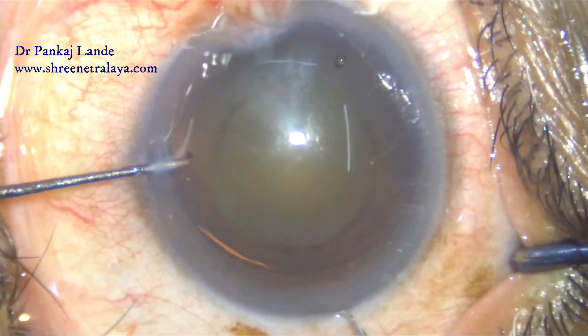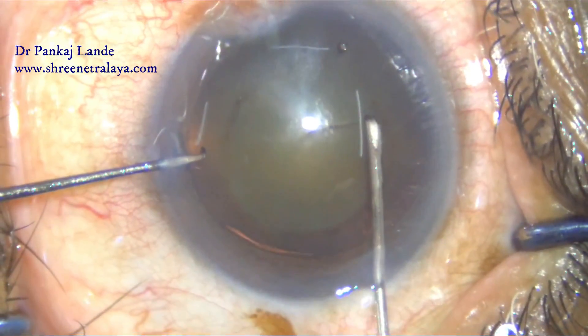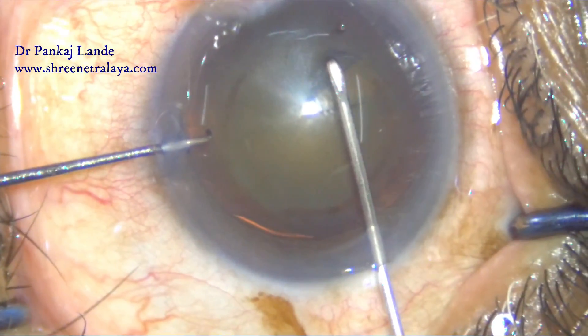A 5.5 millimeter rhexis marker is used and the capsulorhexis is completed with a cystotome.